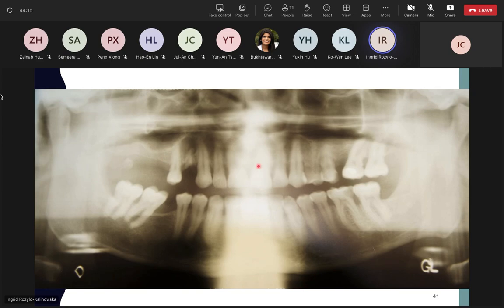The radiograph is yellowish because of film processing. And finally, the markers demonstrating the side of the radiograph were placed too far to the front in the metallic cassette with intensifying screens for the conventional films.